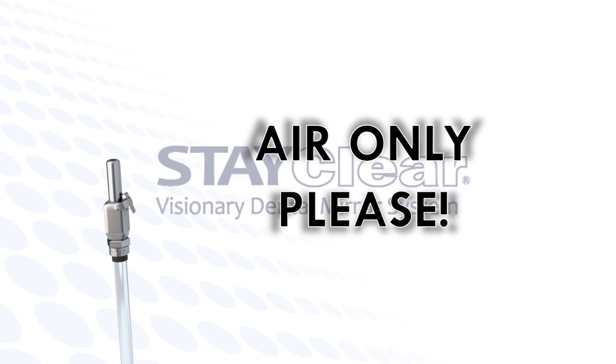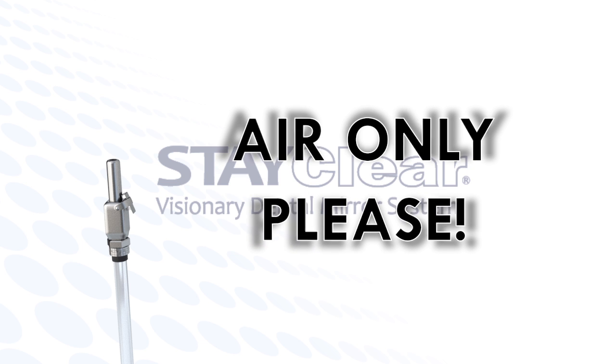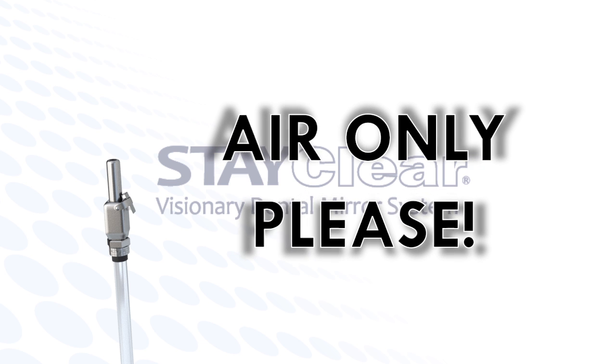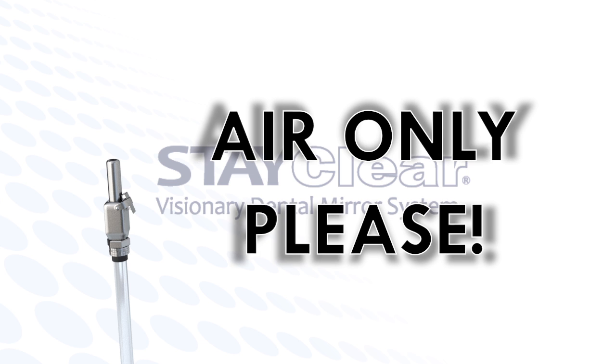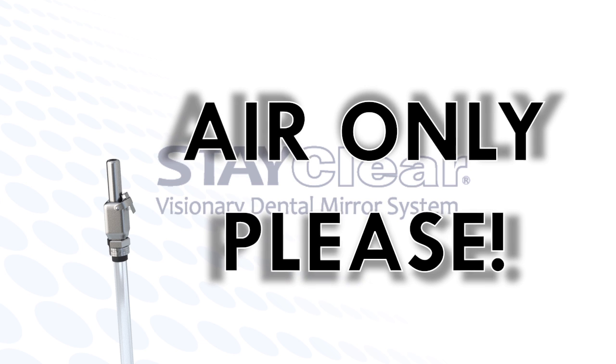Please make sure the air tube is inserted into the air system only and not water. Again, insert the air tube only on the air side, making sure not to attach StayClear into anything but air only, please.